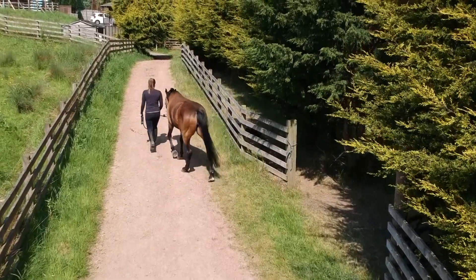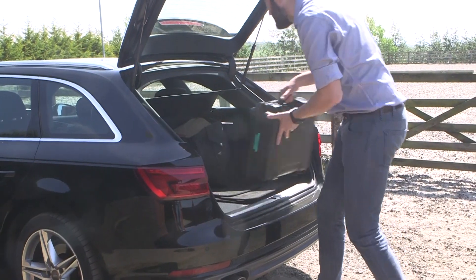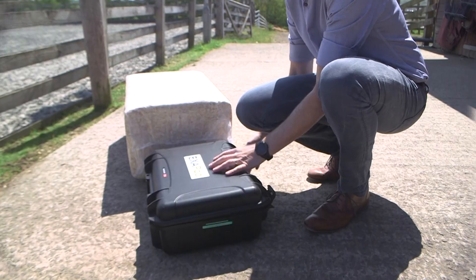Designed with the modern vet in mind, the scanner is lightweight and robust, allowing you to move between the practice and yard with ease.